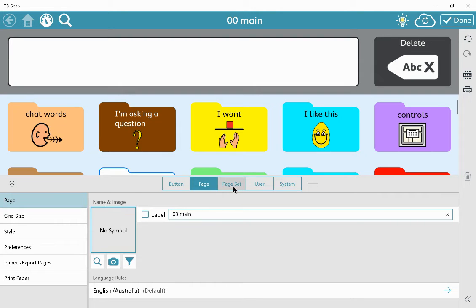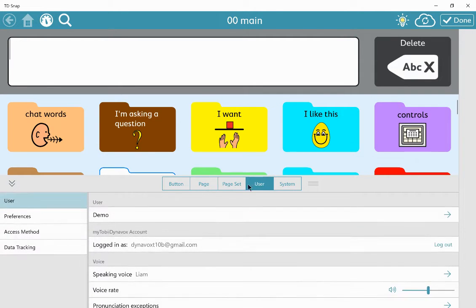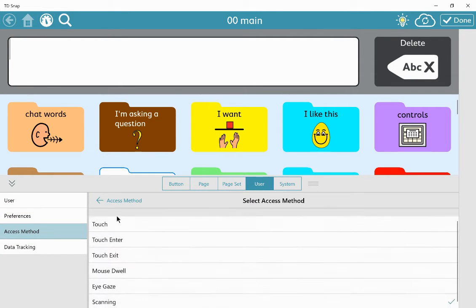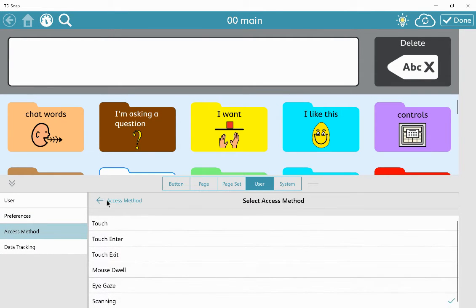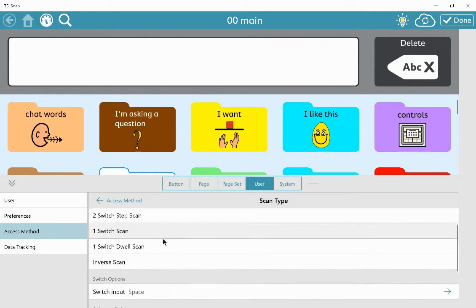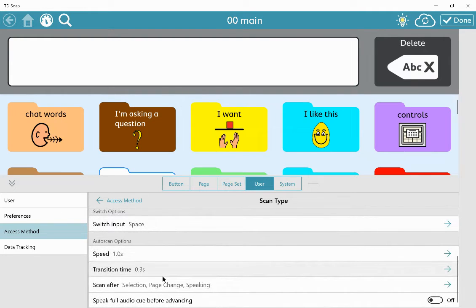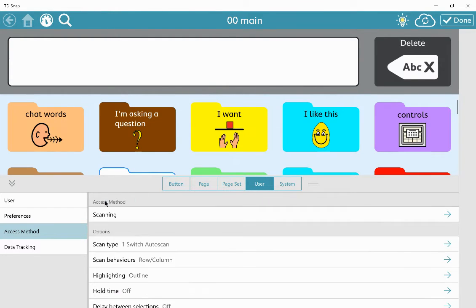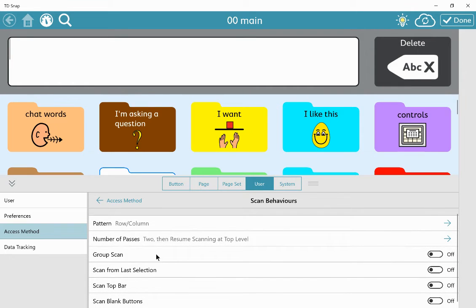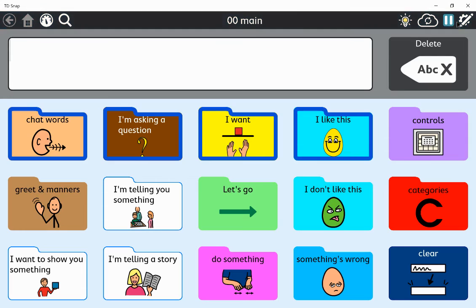And then in my user access method, scanning, I've got set one switch scan. Scan behaviors, we need group scan turned on. Click done.